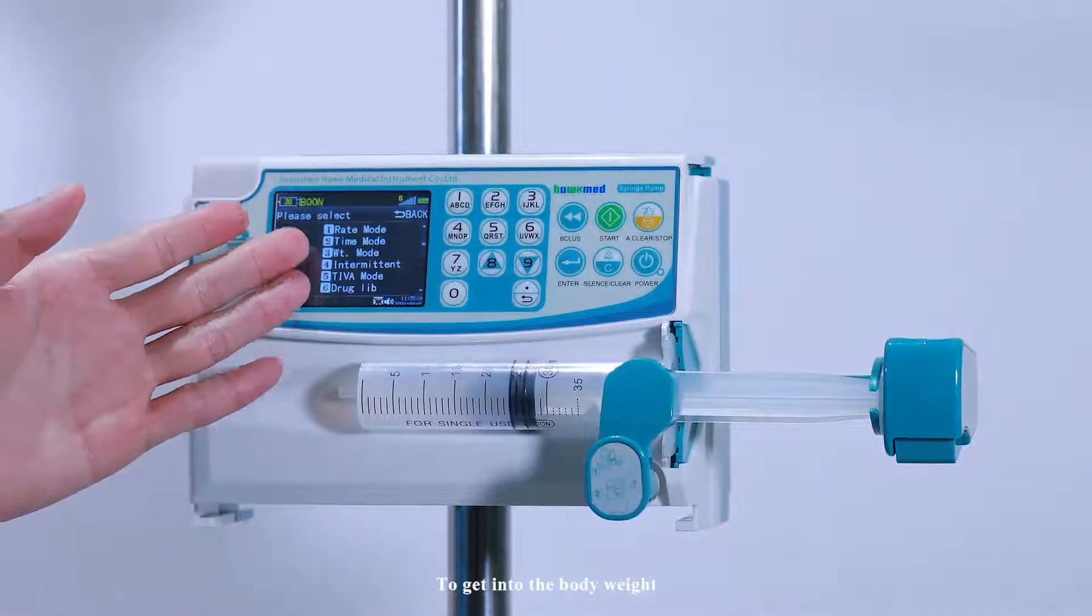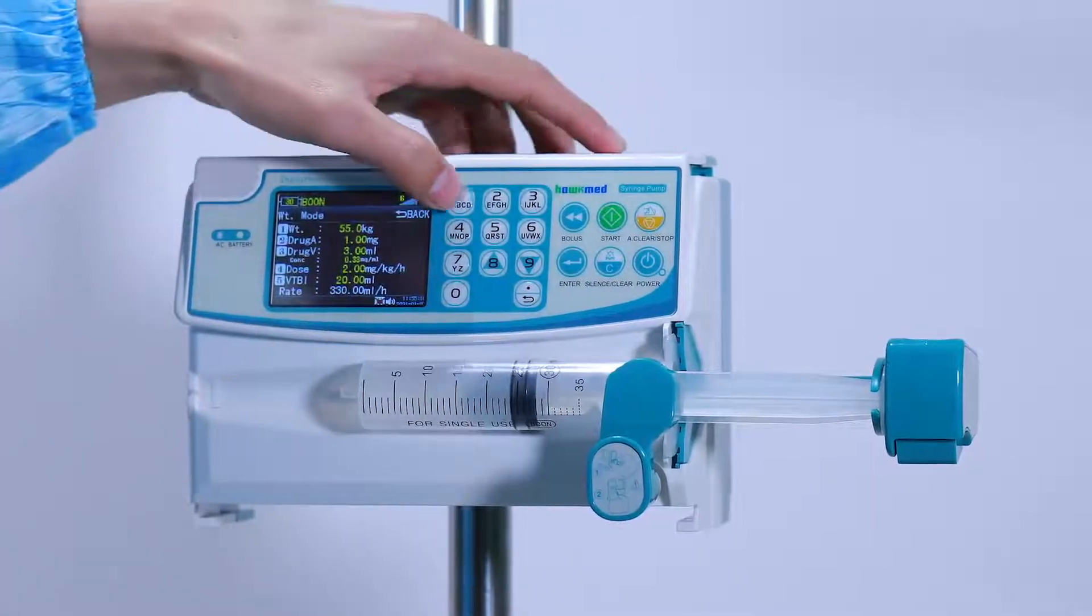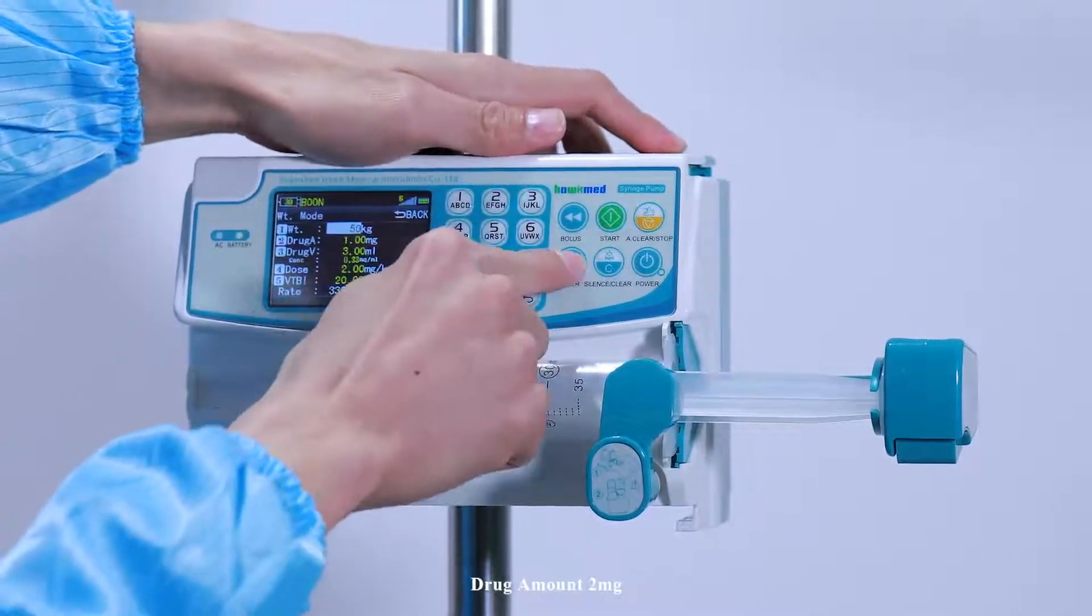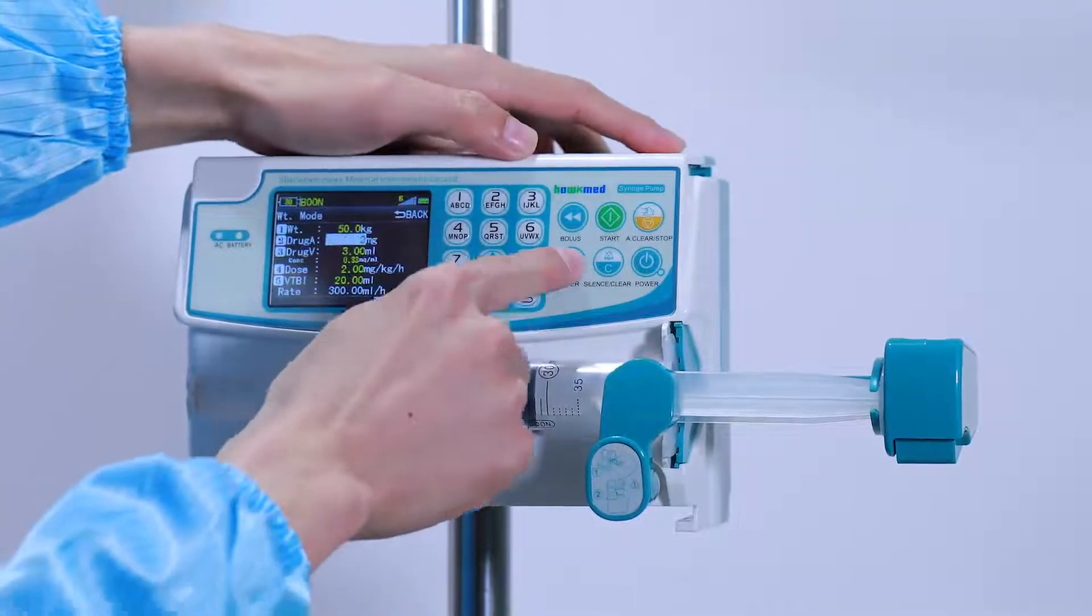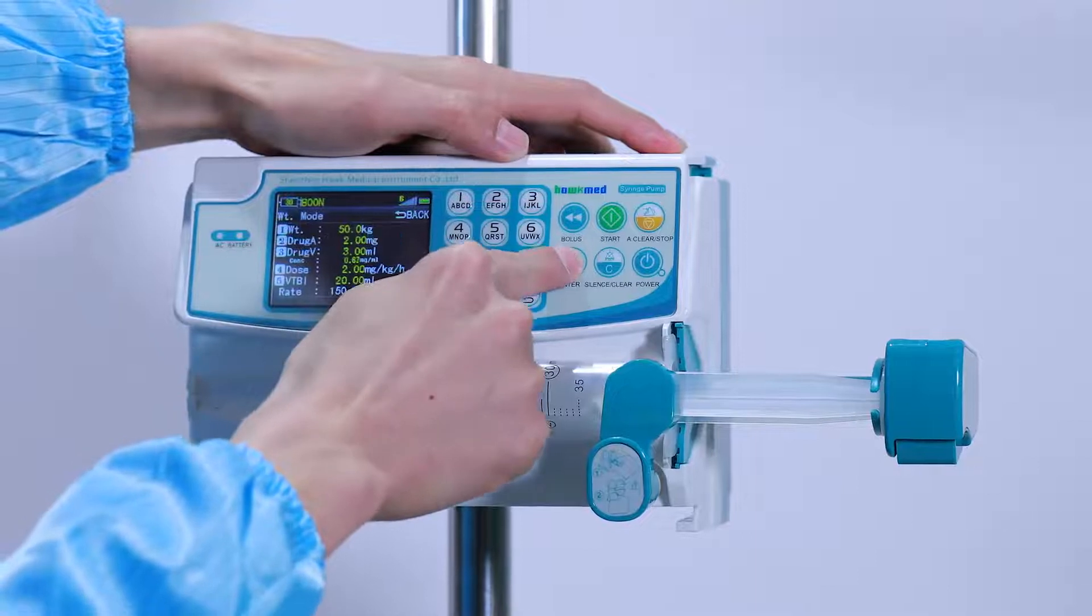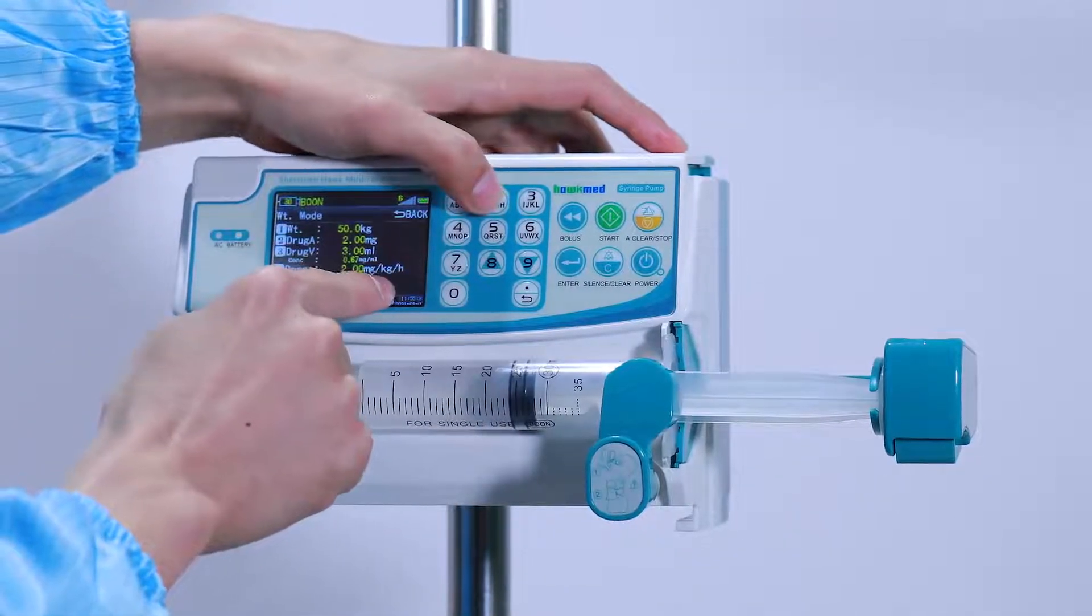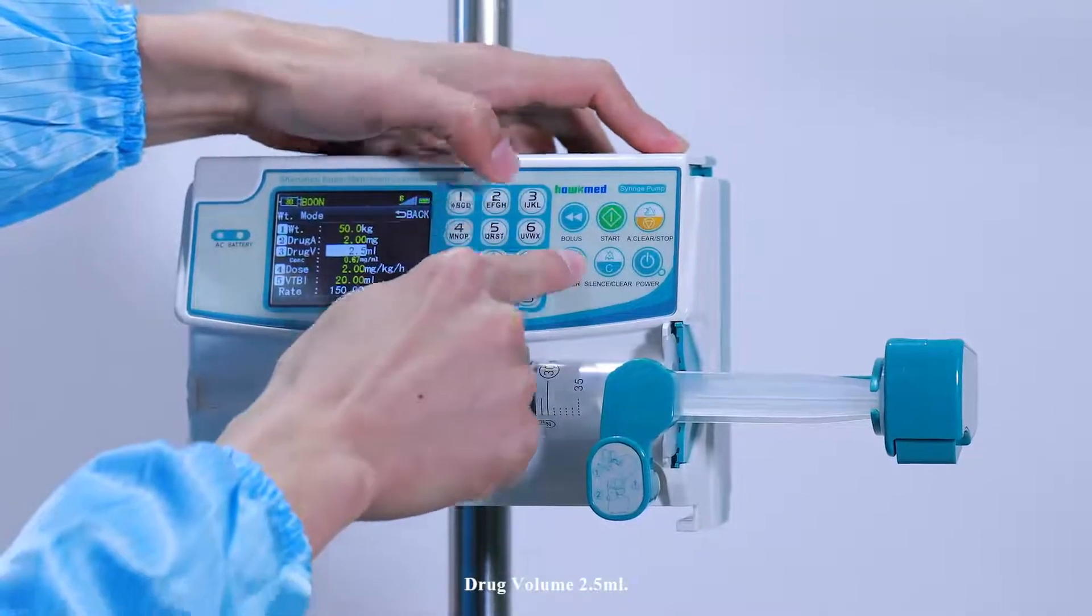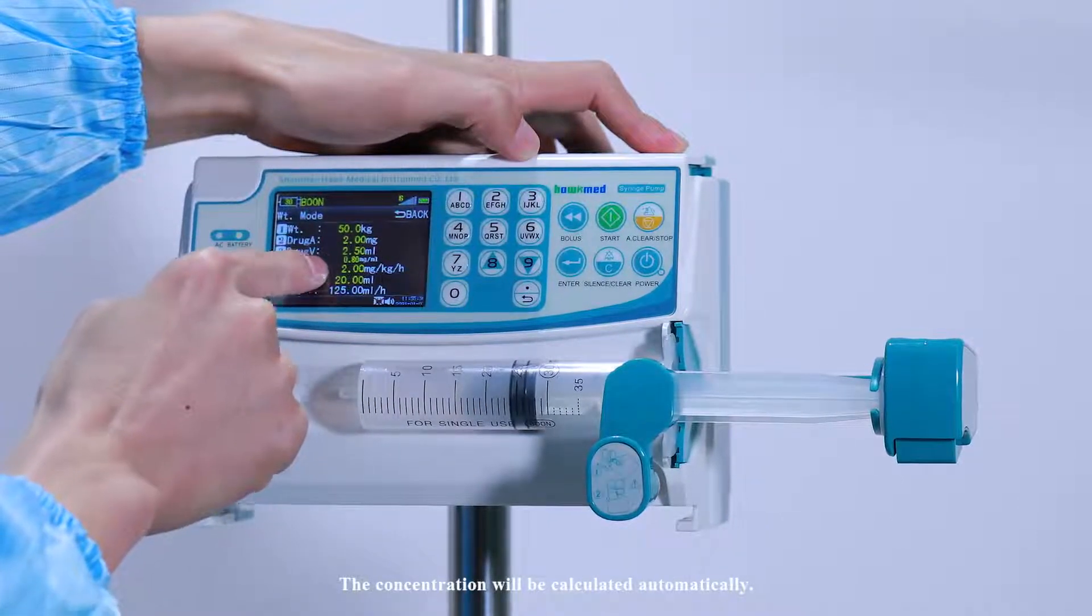To get into body weight mode, press 3. Input body weight like 50, drug amount 2mg, drug volume 2.5ml. The concentration will be calculated automatically.